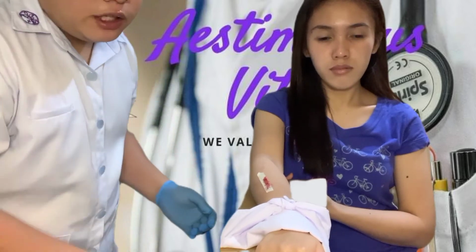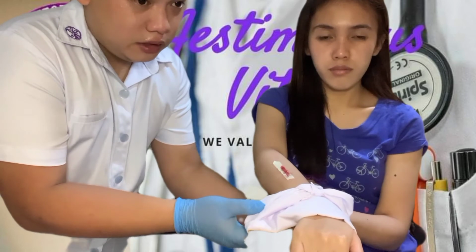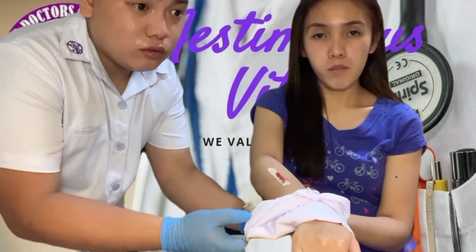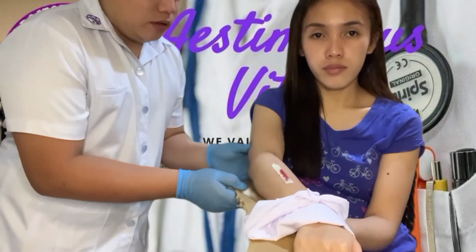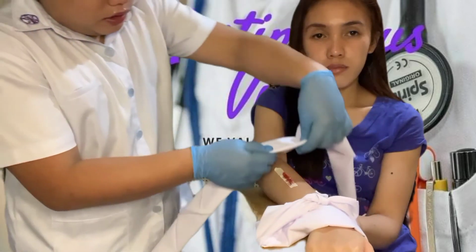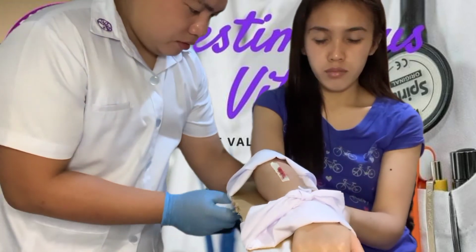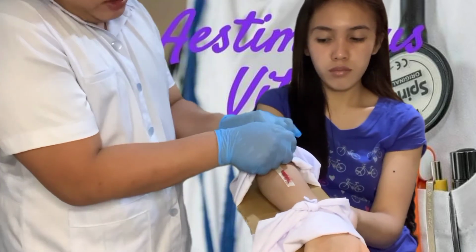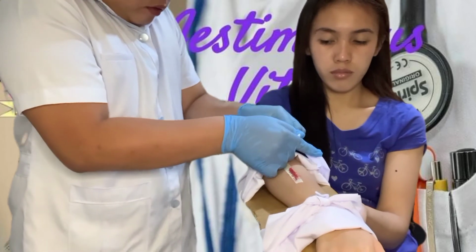Next is ask the patient to support this area while you tie above the injury. It should be wrapped completely around the splinted extremity to secure the splint, but it should not be too tight as to block the circulation. So, ma'am, I'll support it. Next I will put the second bandage in the area below, and I'll be doing the same thing as I did on the first bandage.